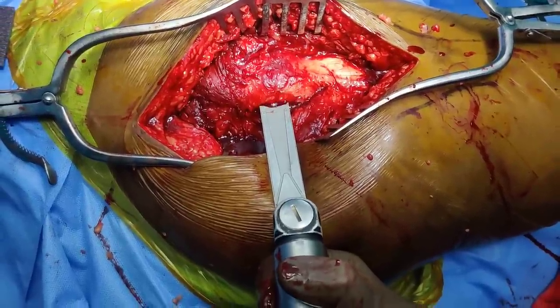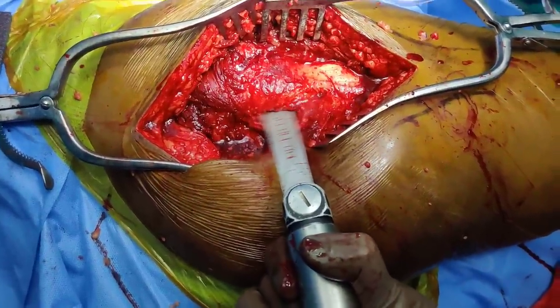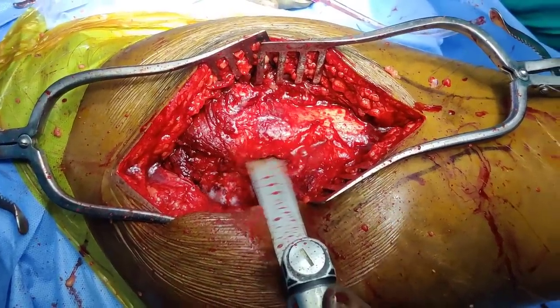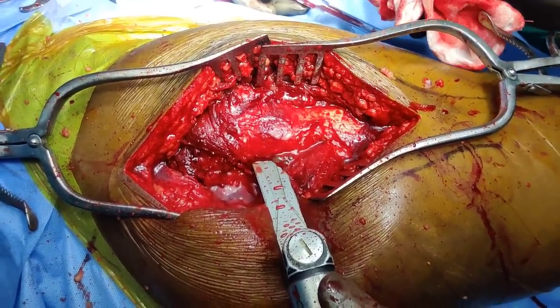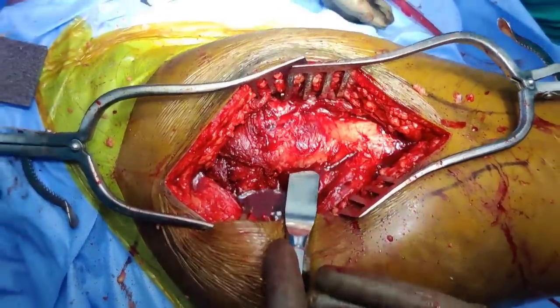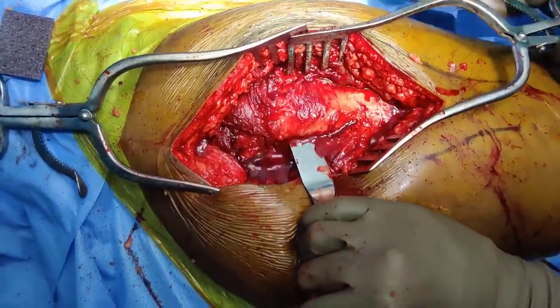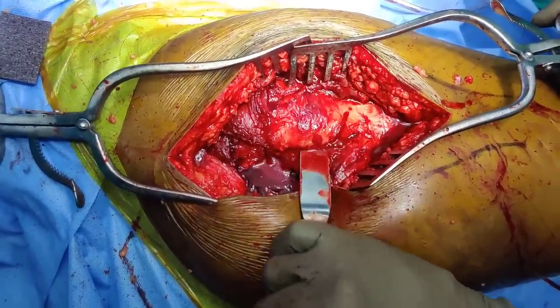Try to keep the saw parallel and then start doing the osteotomy. Once that is done, take a broad osteotome to complete the osteotomy. Then use a hammer and you will hear the crack — that is your osteotomy done.